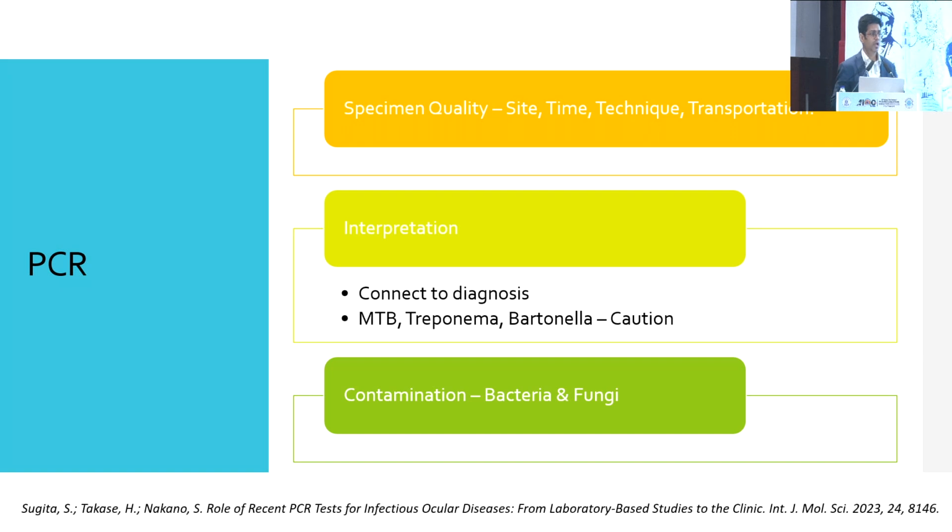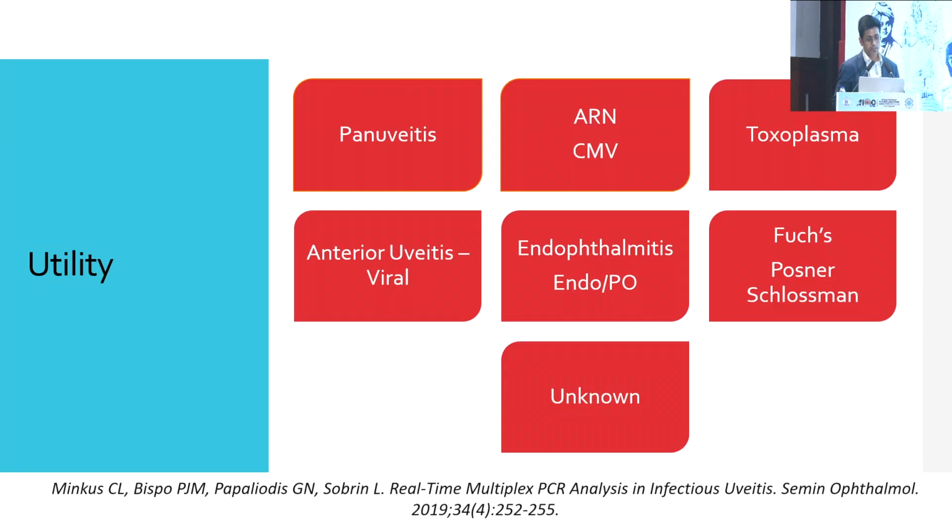It has to be taken at the right time, as ma'am was saying, in the right time period during the infection, with the right technique, and also transportation. The interpretation also requires that it has to be somehow connected to the diagnosis, and it is more applicable in viral infections, and contamination is always there, as I said.